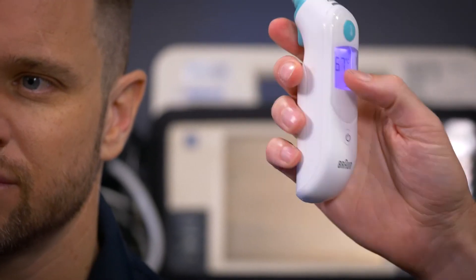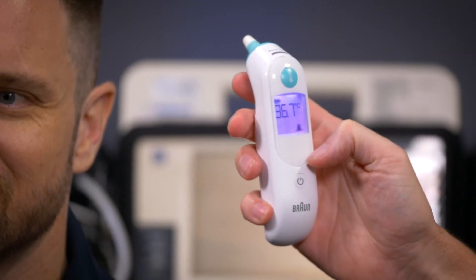Press the little button there and you just shoot the probe covers off, primarily into the bin. A trap for young players: like I said, it won't work unless you've popped that probe cover off and put a new one on — so if it's not working, 99% of the time that's the problem. Easy.